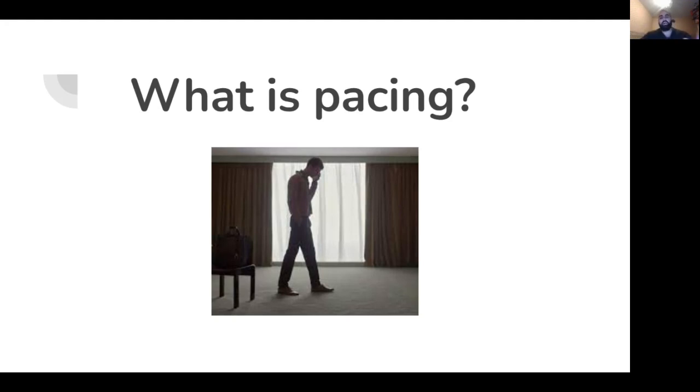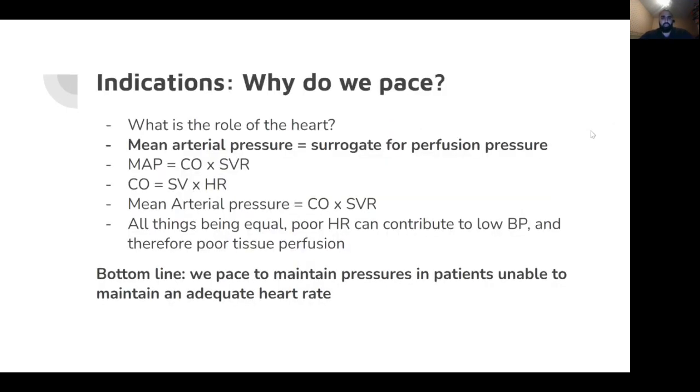So in the context of epicardial pacing, that would be a pacing box. We put certain settings into the box, and that box, through the wires that are attached to the heart, could constantly read an ECG, and then it will intervene when their heart rate drops too low. That's the essential concept. So this begs the question: why do we pace? What's the purpose of this whole thing?